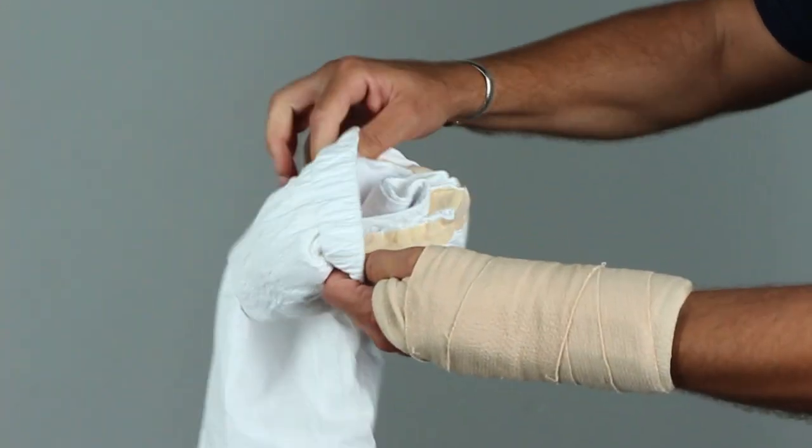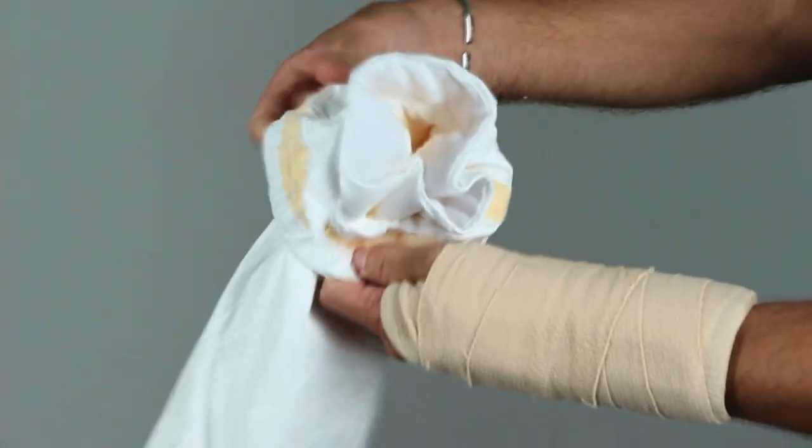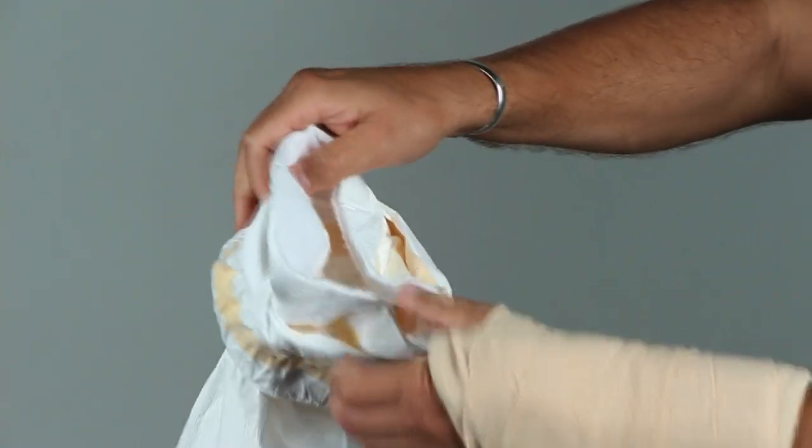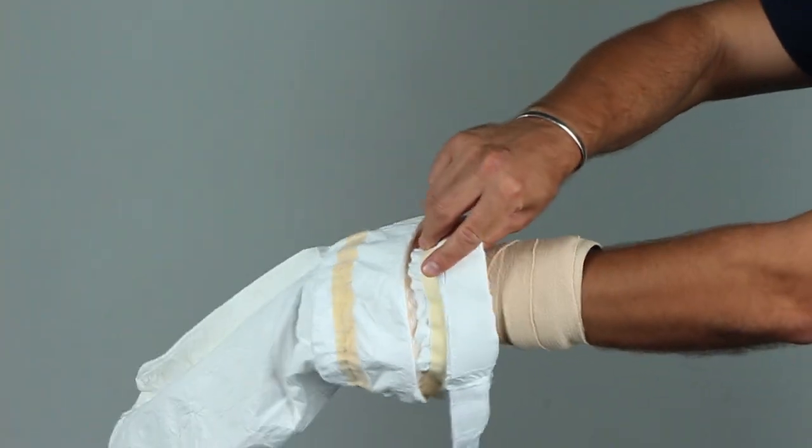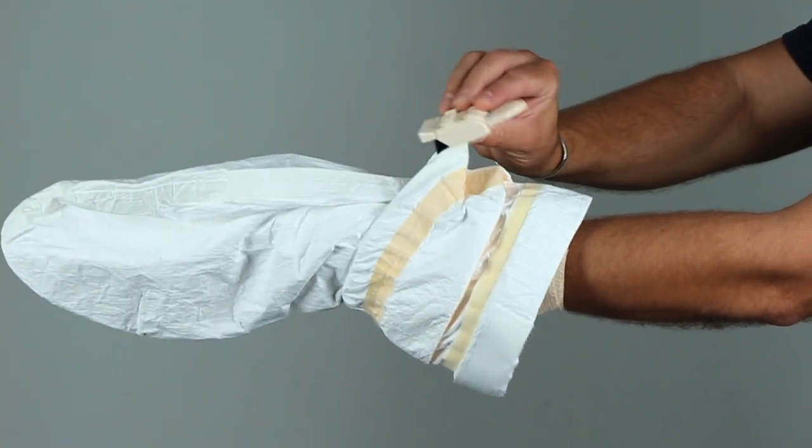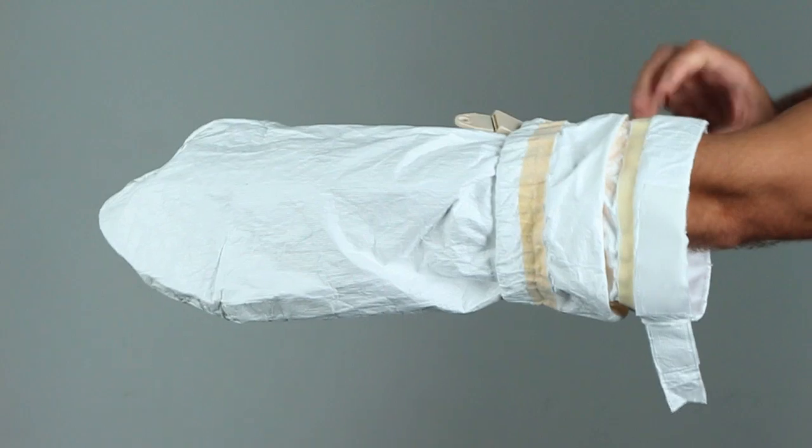Next, fold the top portion of the cover down and then insert your cast or bandage into the sleeve. It will be positioned correctly when the soft terrycloth material is touching your skin directly above the cast or bandage.